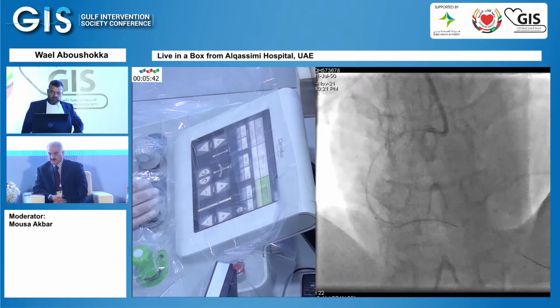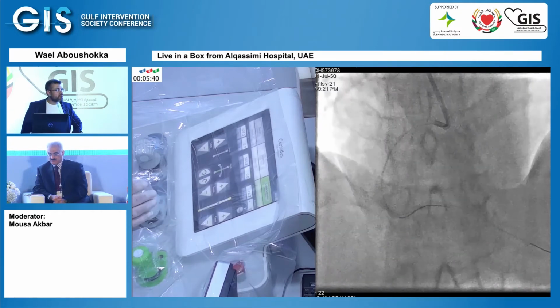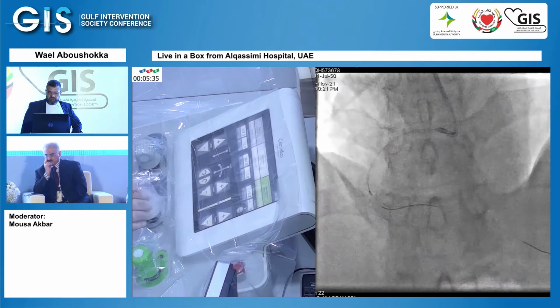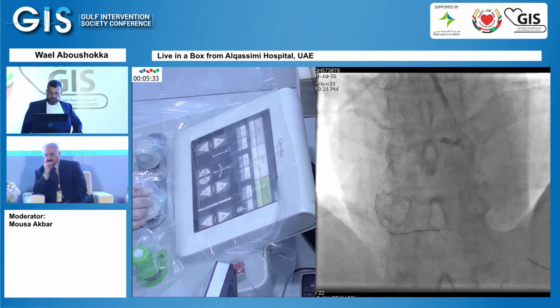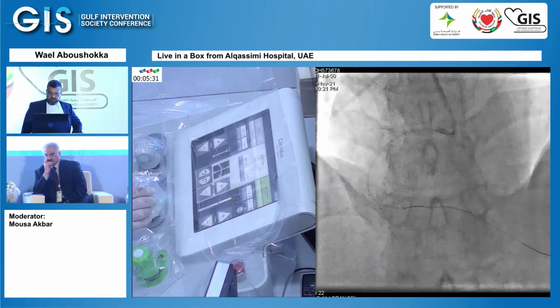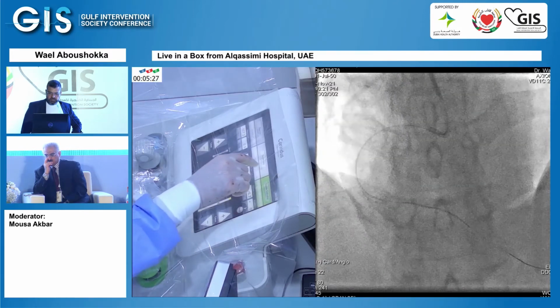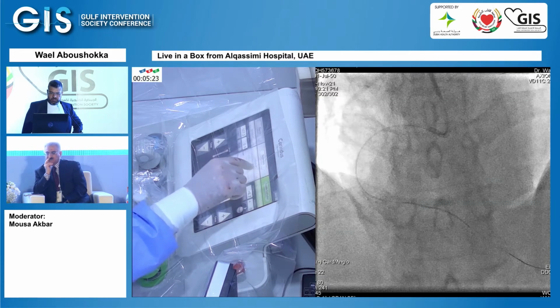Now we need to go to the PDA, because there are a lot of branches arising from there. Okay, we went to the PDA, and now we will put the ROR, which is rotate on retract.